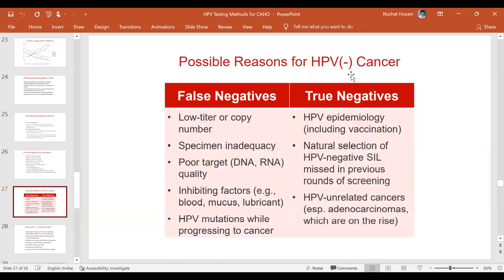The possible reasons for a negative HPV result include false negatives — very low viral titre, low copy number, inadequate specimen, poor DNA or RNA quality, or inhibiting factors like blood, mucus, or lubricant in the sample. HPV mutations occurring while progressing to cancer may no longer gel with primers or hybrid capture technology. True negatives can occur in post-HPV-vaccination populations, natural selection of HPV-negative SIL, or HPV-unrelated cancers such as gastric-type adenocarcinomas of the cervix.